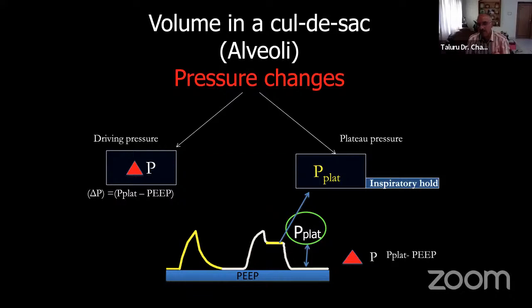you measure your patient. Then on a predicted weight, but not looking at the patient, it is criminal to guess somebody's weight. And don't set the tidal volume just by looking at the patient, or at what you measure. It is always based on the predicted height. Otherwise, you have lost the plot there only. So one of my teachers used to say, your ICU is as good as the number of tapes you have. So you always have to carry a measuring tape.